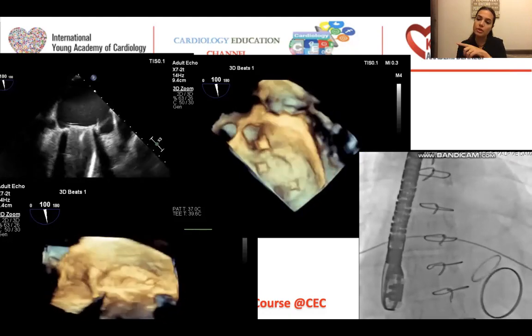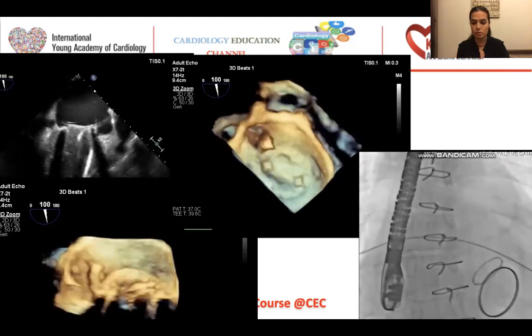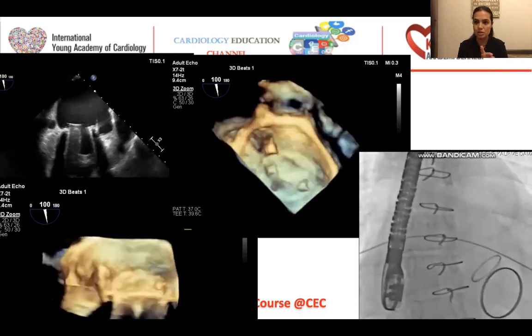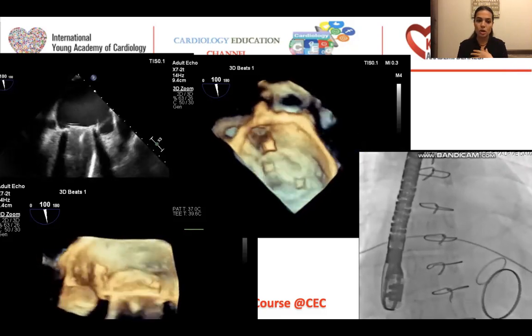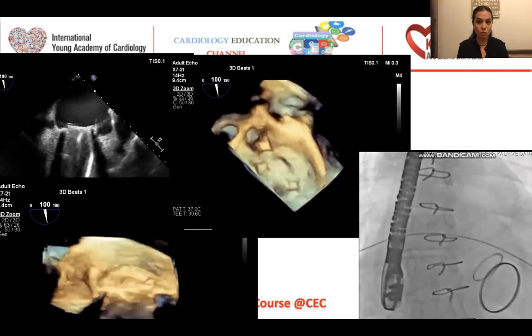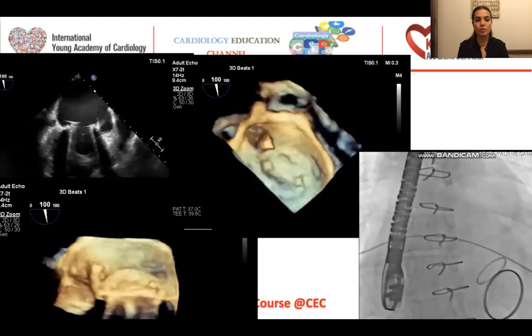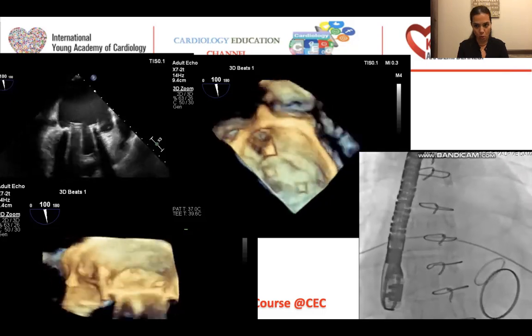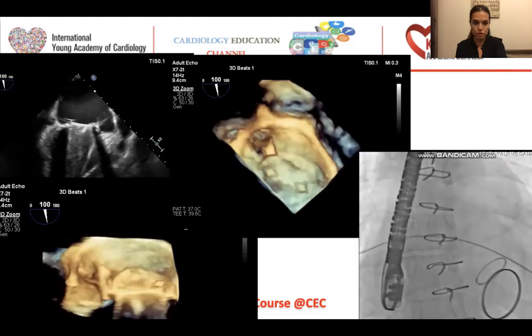As you know, the bigger ring is for the mitral valve, and the smaller ring is for the aortic valve. So in the fluoroscopic view, it really looks like we just passed near the aortic valve, but in echocardiographic images, you can appreciate that we just passed through the laterally located mitral paravalvular leak. So when the operator saw the TEE images, he was convinced, and we continued our procedure.